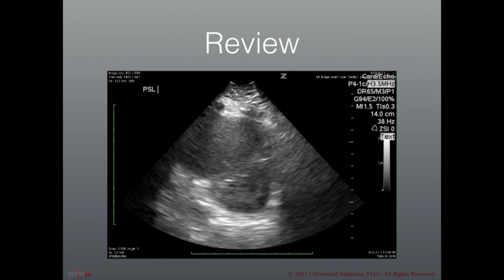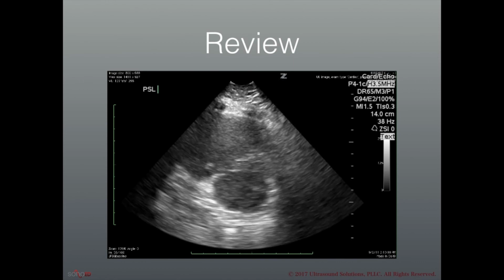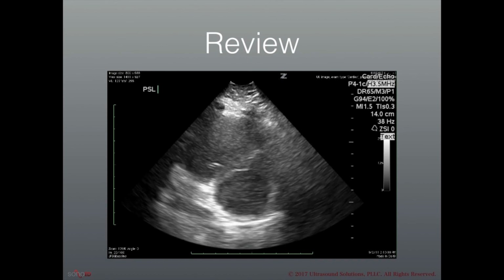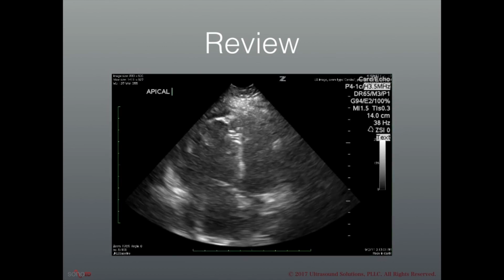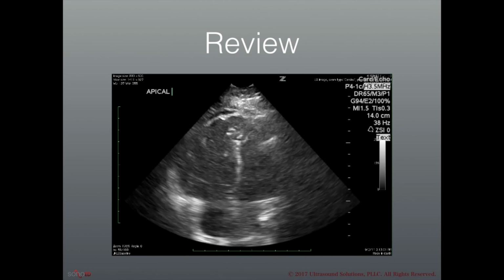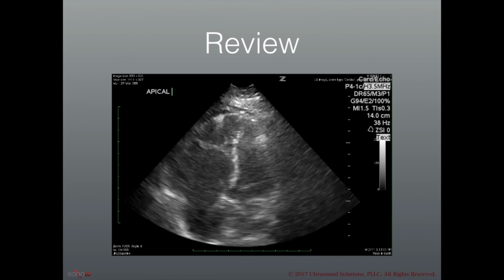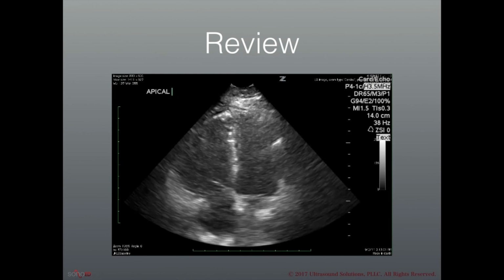Lastly, let's look at a couple examples of acute right heart strain. Here's the D sign, a dilated right ventricle with a compressed interventricular septum, making the left ventricle look like a capital D. Here's acute right heart strain in the apical 4-chamber view. The right ventricle is well over a 1-to-1 ratio, the diameter of the left ventricle. And you can see the interventricular septum is deviated slightly inward to the left ventricle.